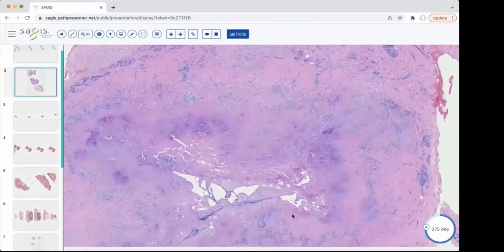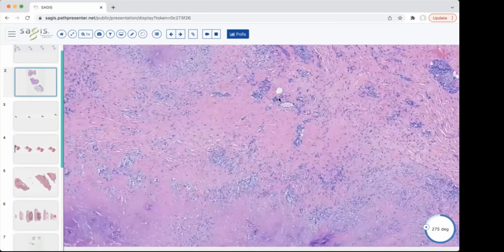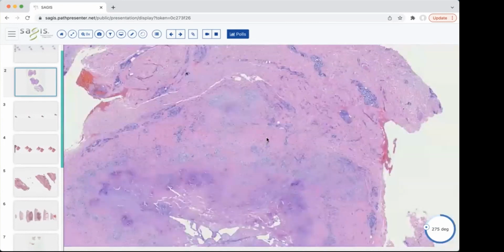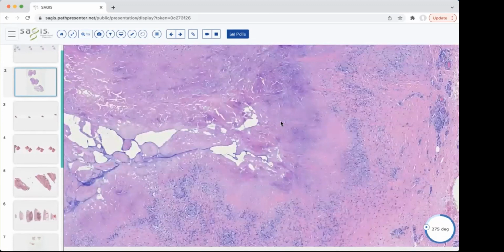This diagnosis also has a little bit more of that sort of busy dermis differential or somewhat fibrotic dermis, and the histiocytes can be a little bit interstitial as well. Just kind of highlighting that there. But that deep red color is fibrin, and it's very common for this diagnosis, common on the elbows, knees.